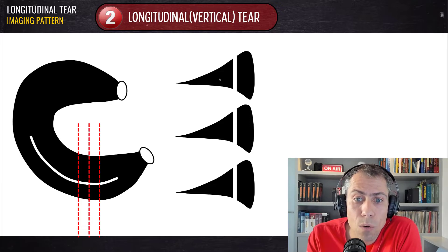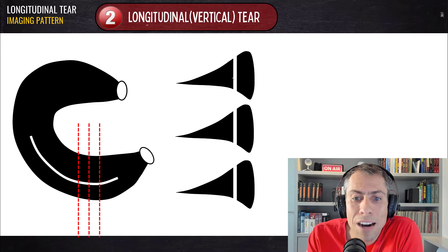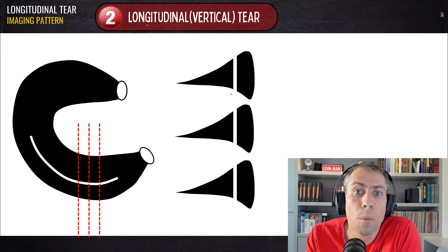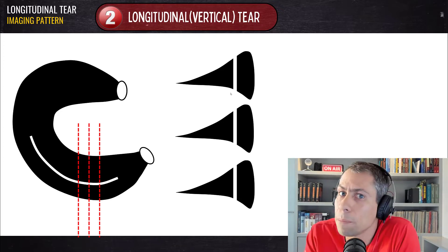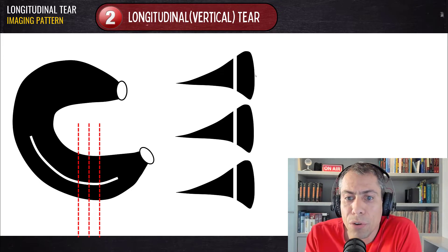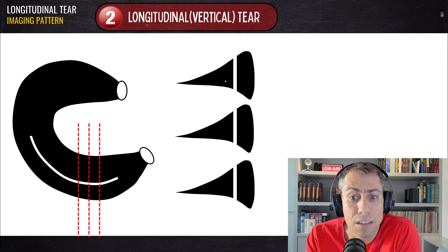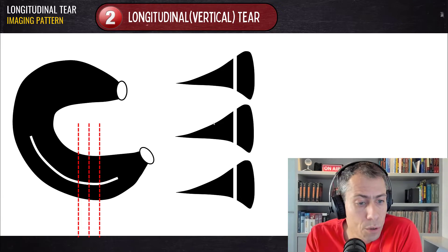If the tear moves toward the inner portion across slices, that is a marching cleft sign, which is a sign of an oblique tear — a parrot beak tear — and that's another thing I'll cover in another video. But for the longitudinal vertical tear, the distance between the tear and both the periphery and the inner portion of the meniscus remains the same across different slices in the short axis. Keep that in mind — it's important to understand.